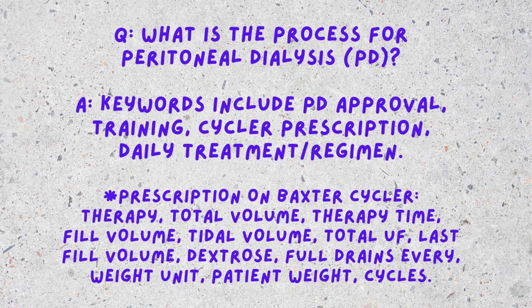So some of the prescriptions that will be set is the therapy, which is usually tidal, which is softer on the body. It's not just a harsh drain. The feeling of peritoneal dialysis is really something that one can't explain unless you go through it. It's kind of like a suction. So at a point, if that suction is running up on dry fluid or emptying fluid, it could cross the threshold into a little bit of pain. So you want to make sure that there's that tidal where it doesn't suck you completely dry.